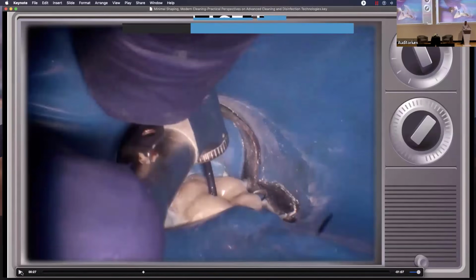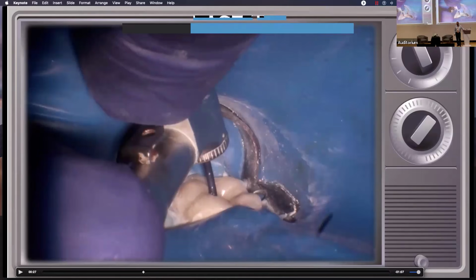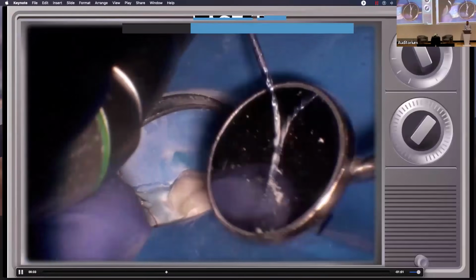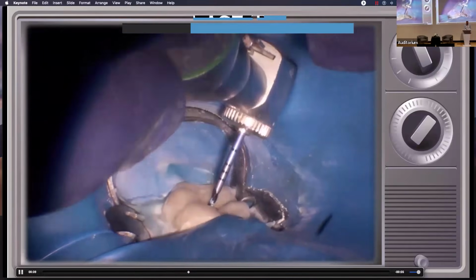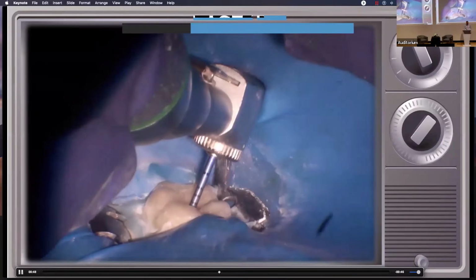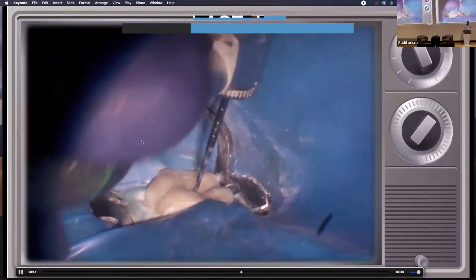When you're using this file, are you using irrigants right now? Or what irrigants are you using? There's irrigant in the tooth. There's bleach in the tooth, but I don't know that it matters. If you want to pick something else, that's fine. But this is not done dry. It's already gone down to 20 in this 23 millimeter canal, so the canals were pretty big once I got in there. Place the bend on it, hook it in the MB, lift the handle so we have straight line access, and we're just funneling. I'm not really trying to create any shape in the tooth. I'm just trying to make it easier to get the small path files in there without dinging them up.